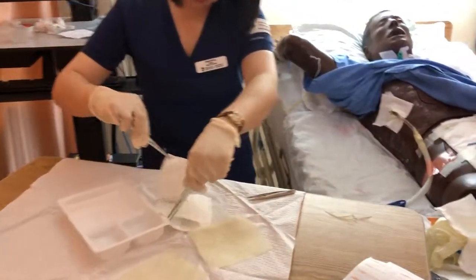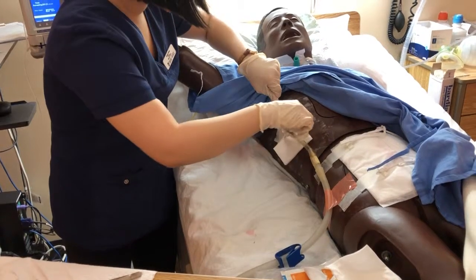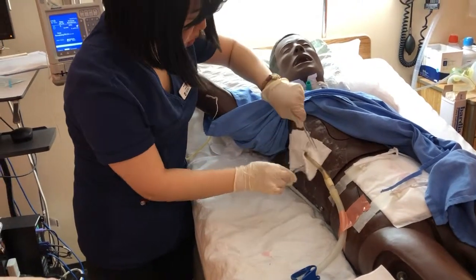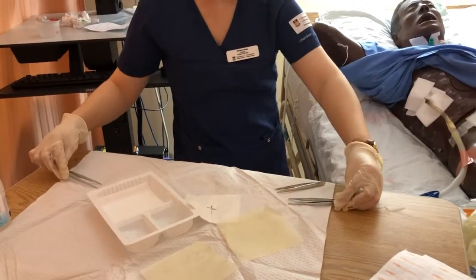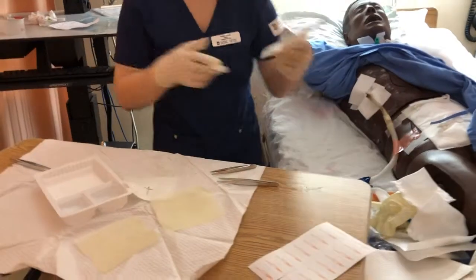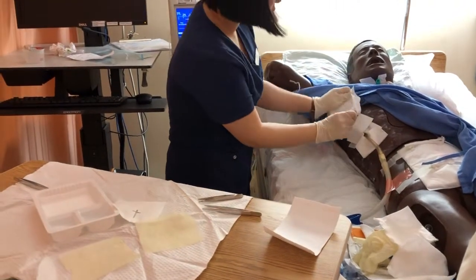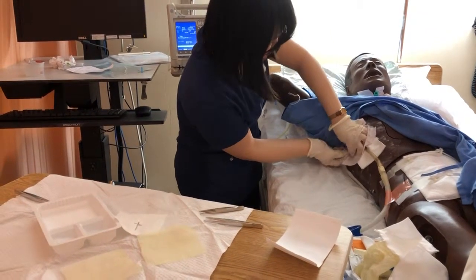And the other 4x4 goes the other way, like this. So make sure you fully occlude. And then we're gonna put Medifix to make sure it's also fully occluded.